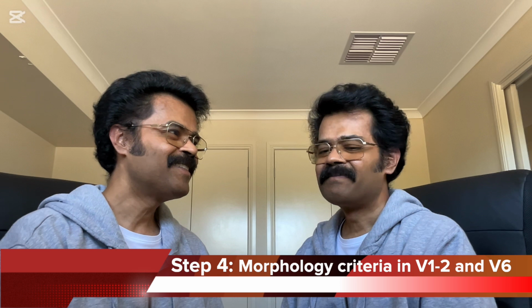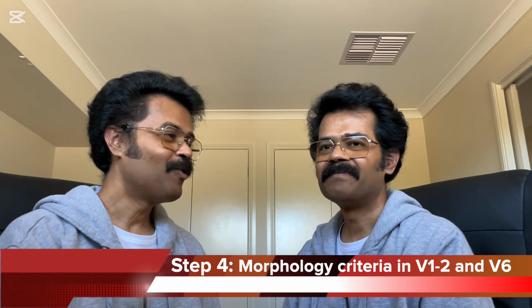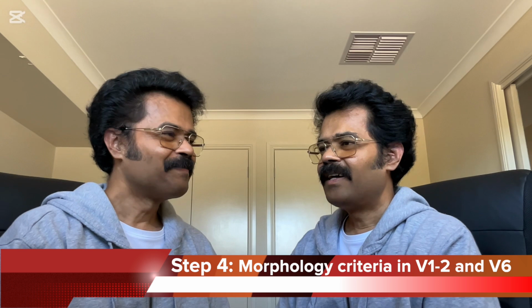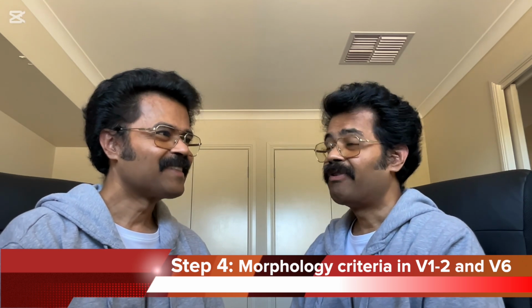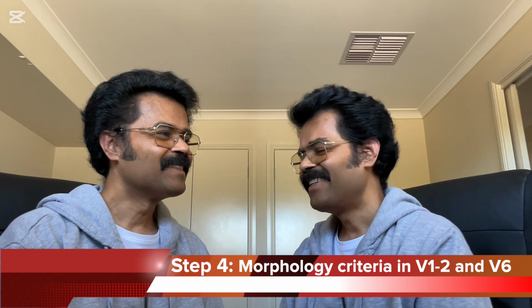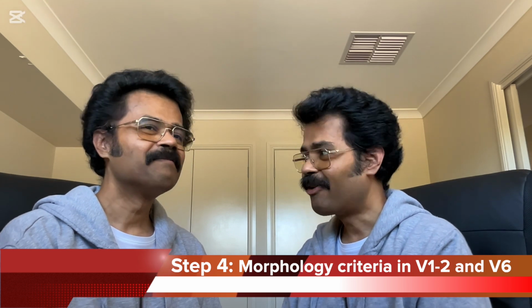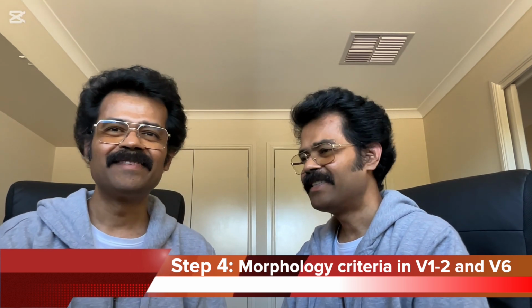I understand that step 4 can be quite overwhelming and complicated. Thank you. I agree with you that step 4 can be quite overwhelming and quite complicated, and sometimes it can be quite difficult to memorize this. Don't worry about it. You can look it up on the internet or in your textbook.